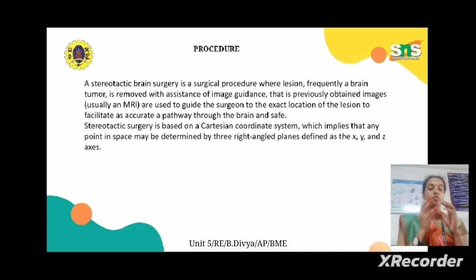We have the image guidance beforehand, and using that, the surgeon is guided in how the surgery is to be undertaken.